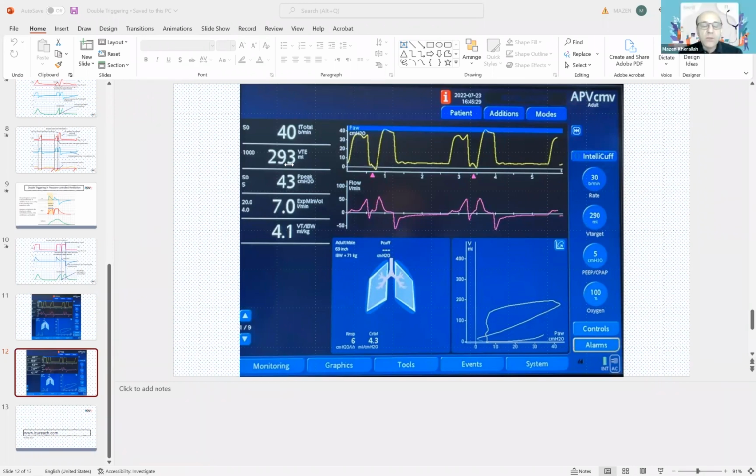Yeah, so the cause of the prolonged inspiratory time of the patient could be either because of the increased inspiratory drive, as I mentioned with COVID patients, those patients having a firing of the respiratory center very deeply, frequently, and in prolonged time.